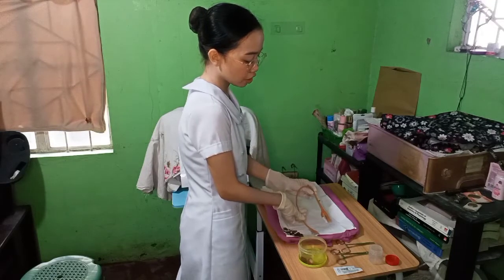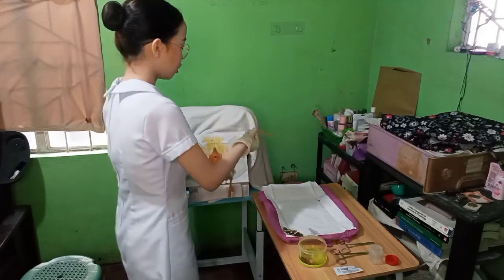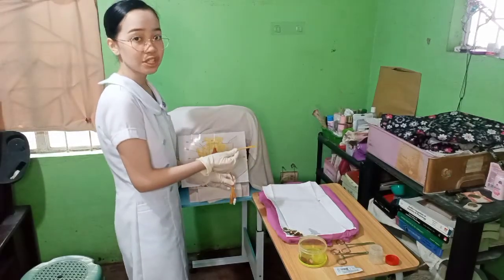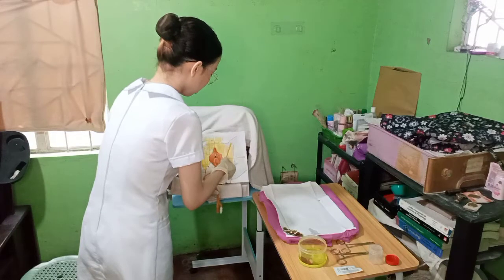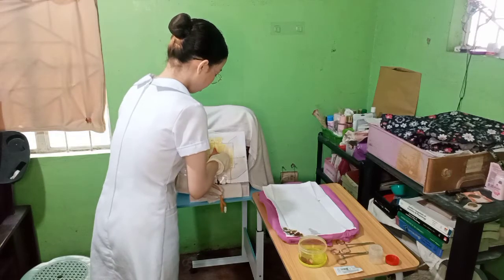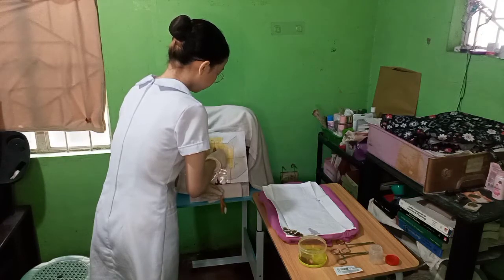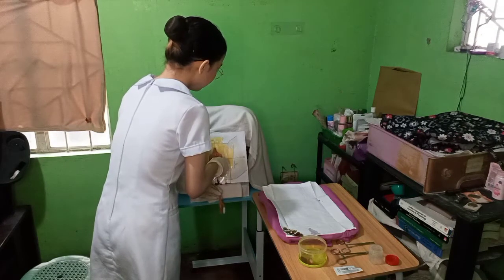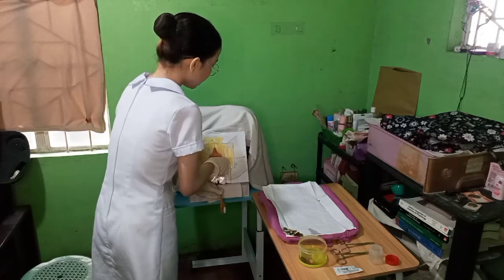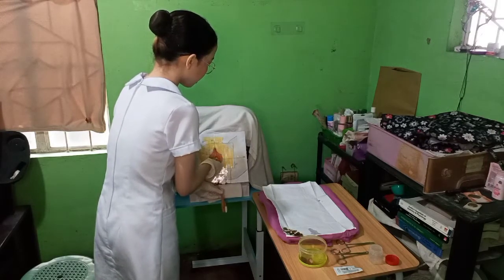And then place the drainage end of the catheter towards the Kelly pad or the urine receptacle using your non-dominant hand to fully drain the urine. And then gently insert the catheter into the urinary meatus. But if there is resistance, do not force the catheter. Ma'am, please take a deep breath. Ask the client to take a deep breath and advance the catheter when the client exhales because the muscles are relaxed during exhalation.